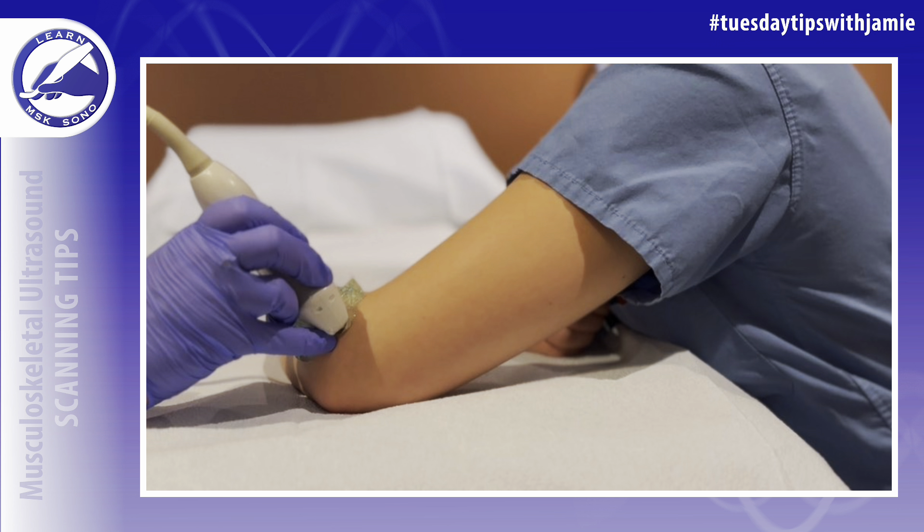To do this, palpate the lateral epicondyle and then place your transducer over it in long axis to the forearm, with the transducer facing towards the patient's head. The proximal side of the probe will be facing towards the patient's head and the distal side of the probe will be facing towards the patient's fingers.